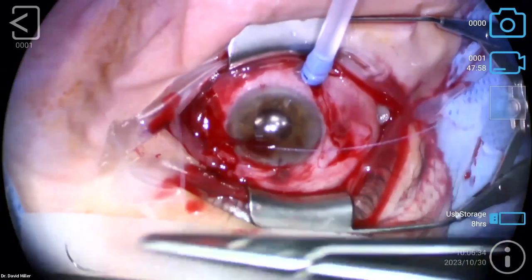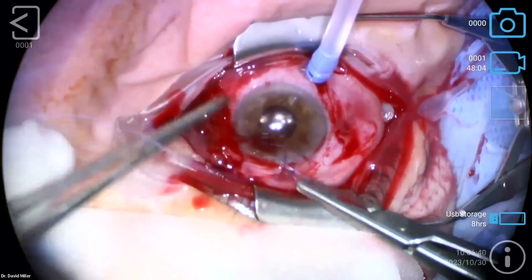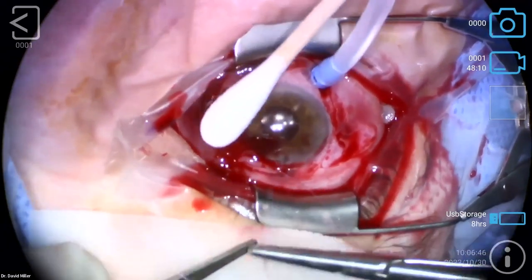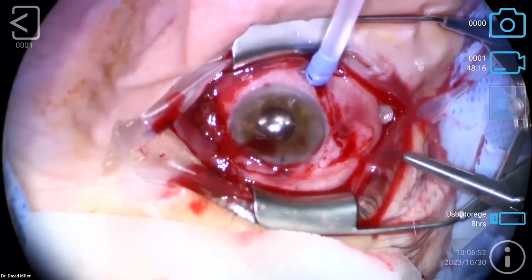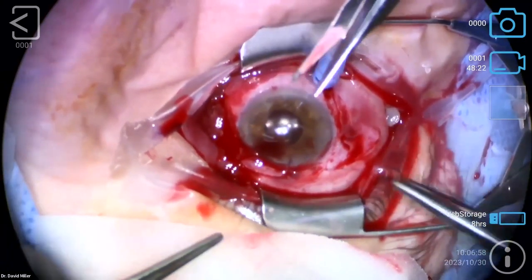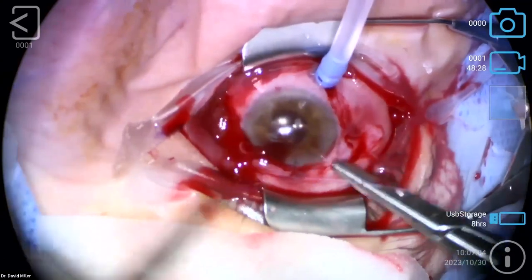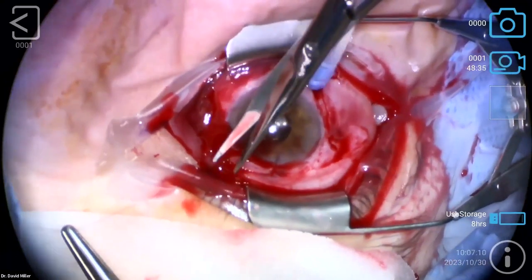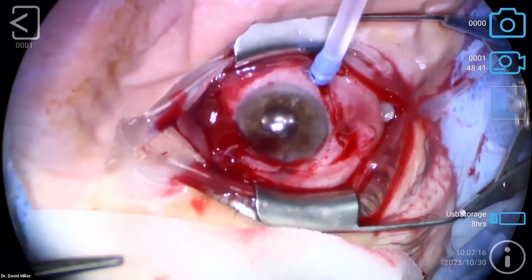And so we want to make sure that we got the conjunctiva up to the point where it's not going to recede and create a problem in terms of exposing the suture, a long-term infection risk here. I've not had a patient come back yet with a late infection, endophthalmitis or something. I've had a couple patients over the years where we went back to cover the suture, though. Usually because they have multiple operations beforehand, scleral buckles or something, and the conjunctiva is just not in good shape for this part of the case. I would not expect this one to be a problem.